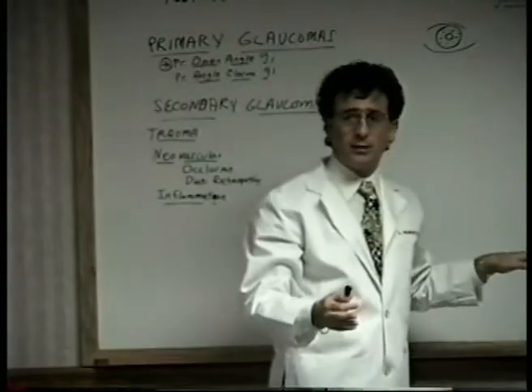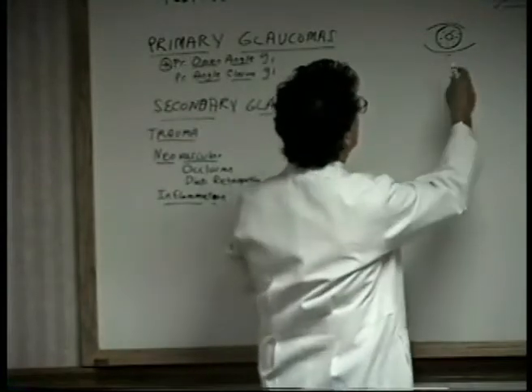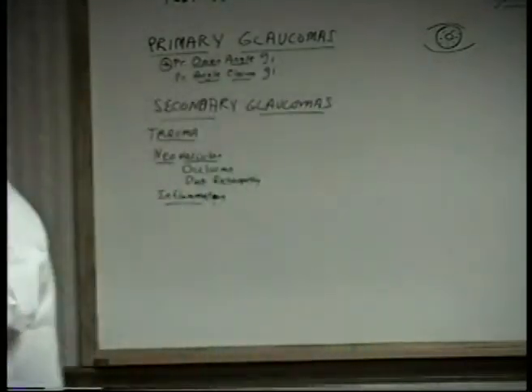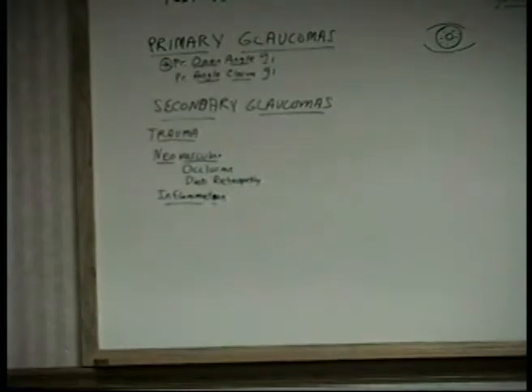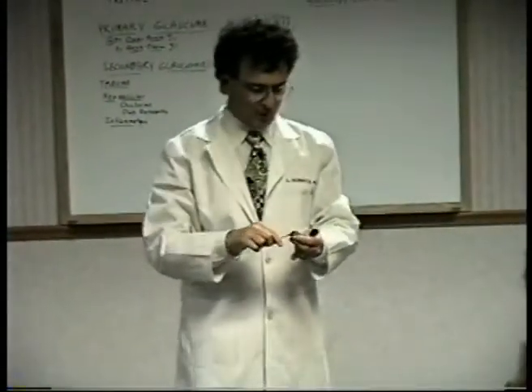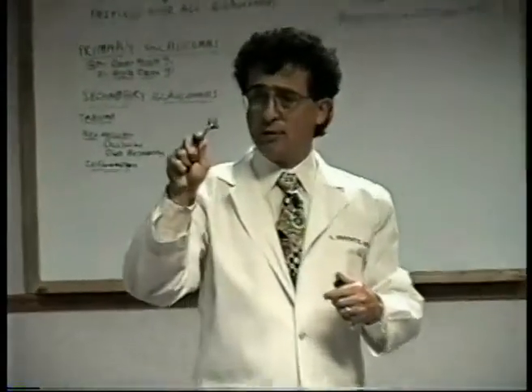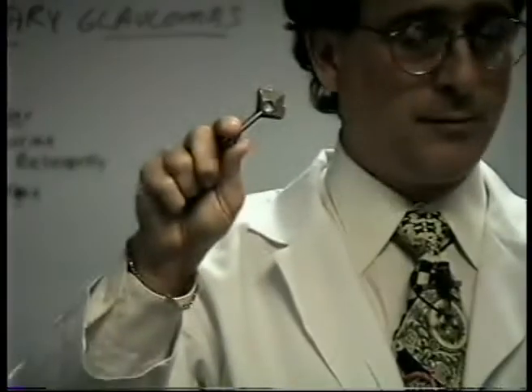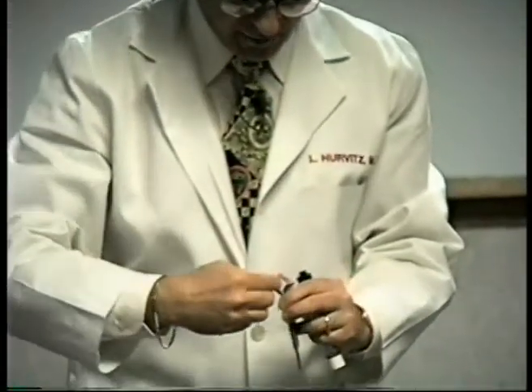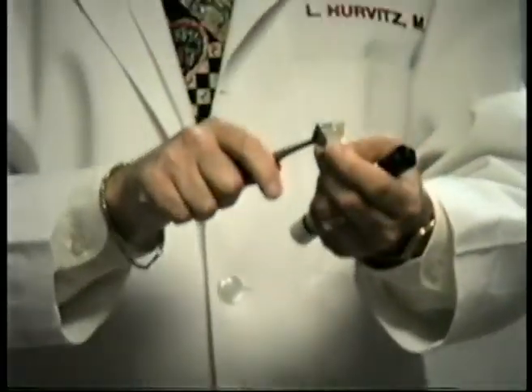And when we look in, we put a little device on the eye. I just happened to bring mine. I don't want to pass it around because invariably somebody will open it up and this glass thing will break on the floor. But this, you numb the eye with a numbing drop and you put that right against the eye. And it holds the eye open for you. You don't feel it, it doesn't hurt. But you can see it's shaped to fit the colored part of the eye. Yeah, you put that right against it.